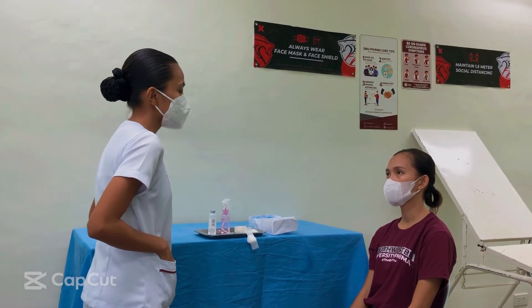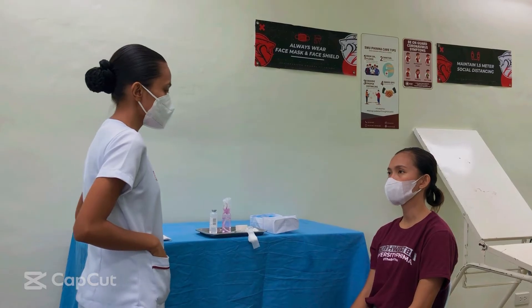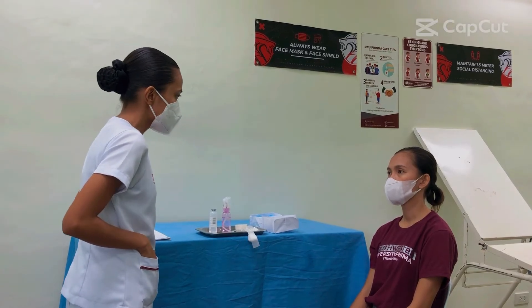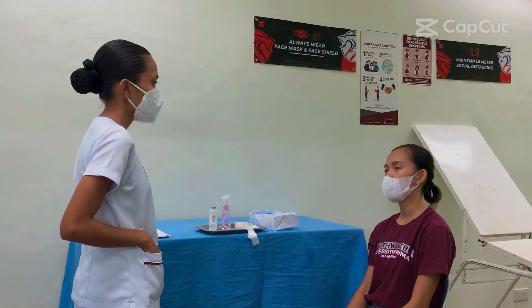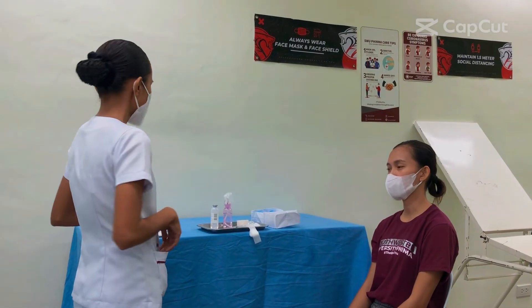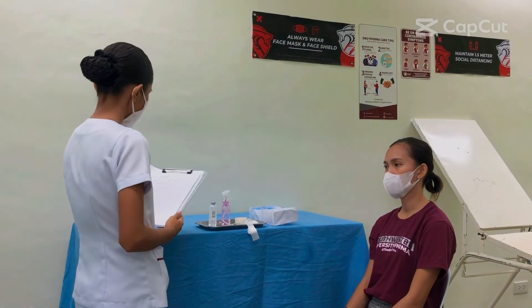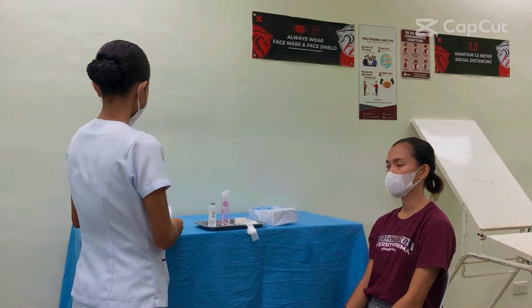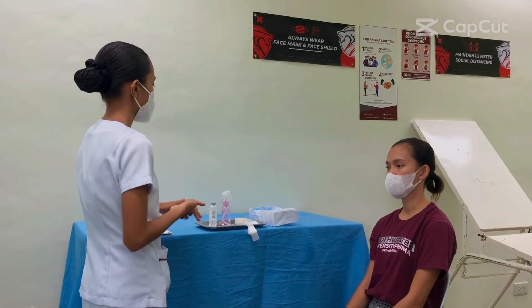Good morning, Mom. I'm Marjorie Milka, your student nurse. May I know your name and birth date? My name is Tikal Muta and I was born on October 15, 2001. Compare the name of the medication and label with the MAR one more time at the patient's bedside.